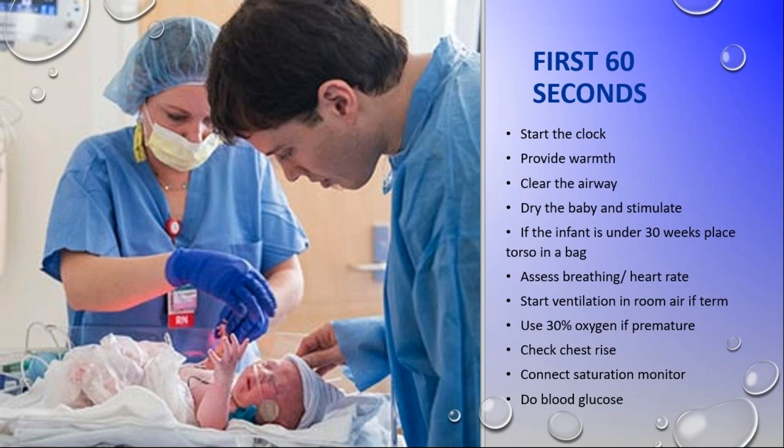If the baby's under 30 weeks, we're going to put it in a bag to keep it warm. We're going to assess breathing and heart rate. We will start ventilation in room air if it's term. We'll use 30% if it's premature. Check the chest rise. Connect the sat monitor and do a blood glucose.